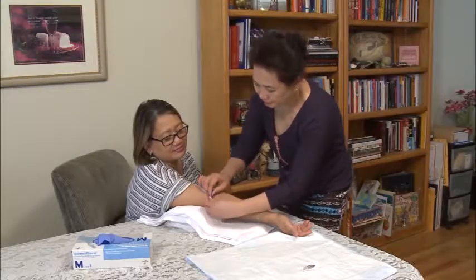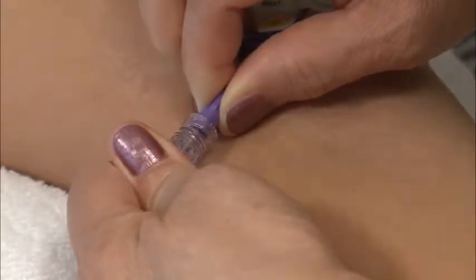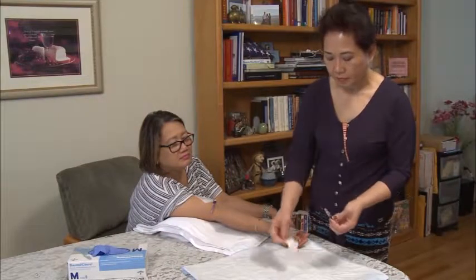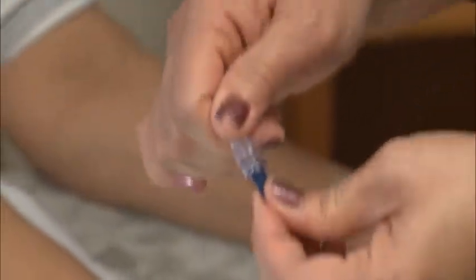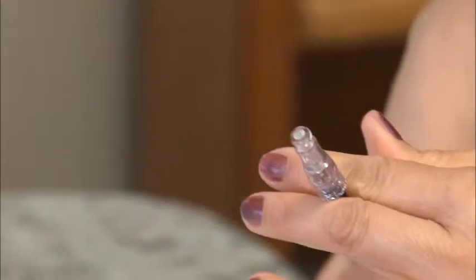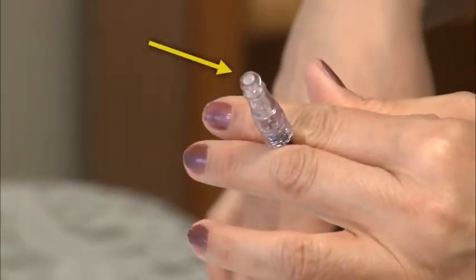Now turn the connector cap on the end of the CVC to loosen it, but do not remove it. Next, peel open the package and remove the new cap. Loosen the protector end tip of the new cap. Then place the protector tip between the middle and index fingers of your non-dominant hand. The cap injection side should be facing up.